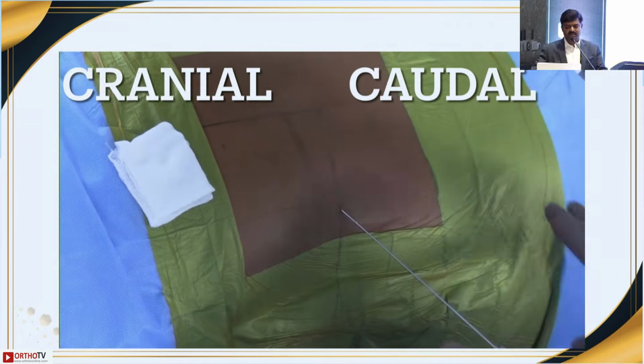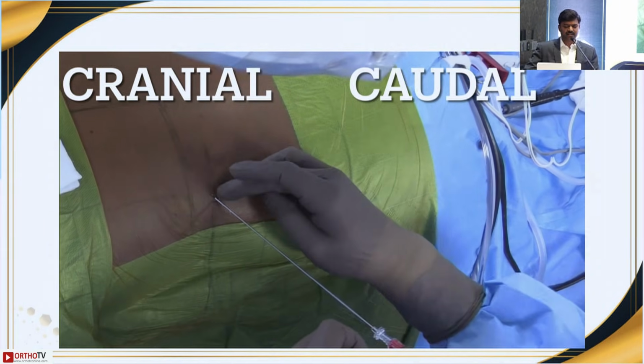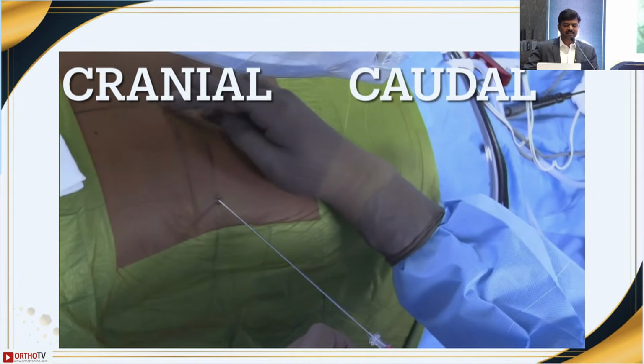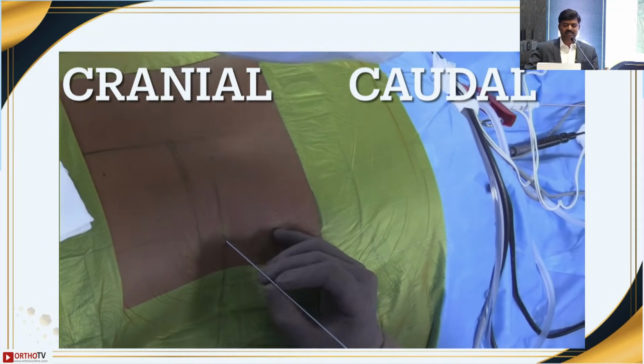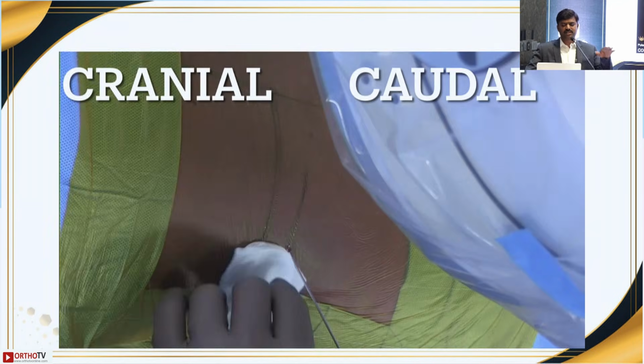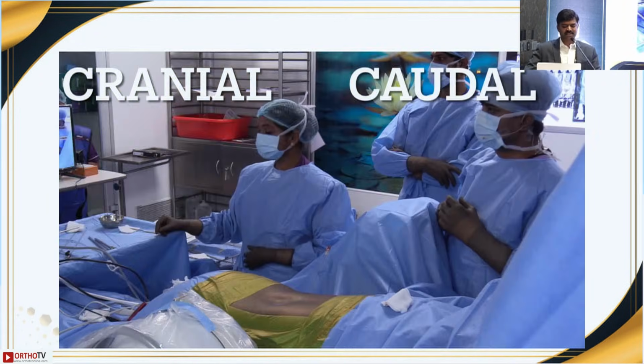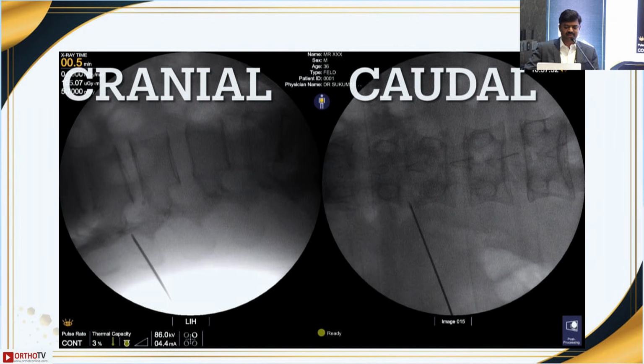Once you have gone there, then the question is the angle. What angle should I go? Again, your target should be the facet initially as a beginner. So you target the facet. If you are more shallow in your angle, no problem. But don't start with a steep angle. You might have difficulty.